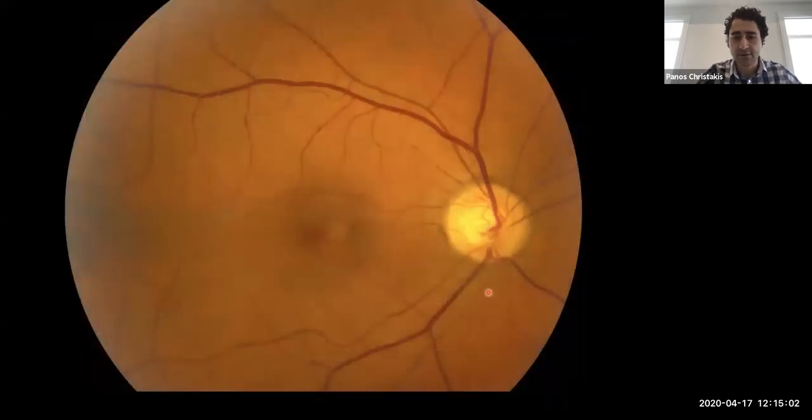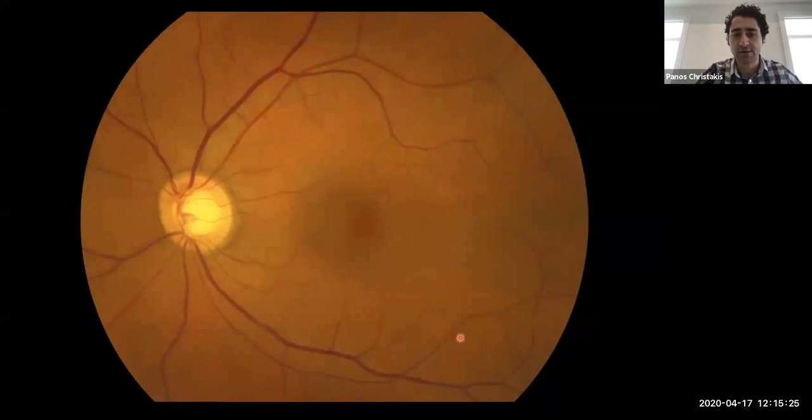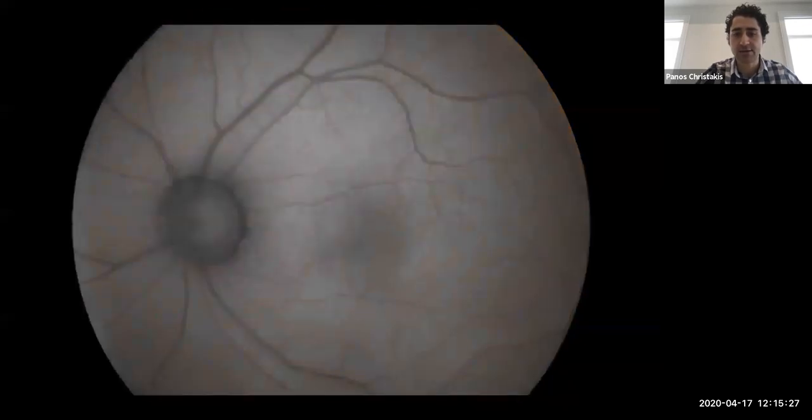This is a fundus photo of his right eye. You could see that there are some RPE changes in the parafovea. Otherwise it looks pretty unremarkable. On autofluorescence, you could see some hypoautofluorescence in that corresponding area. Interestingly, this presentation is not a common appearance of changes related to hydroxychloroquine, and the contralateral eye is normal clinically with a normal autofluorescence. So I think this is one reason why baseline exams are important.